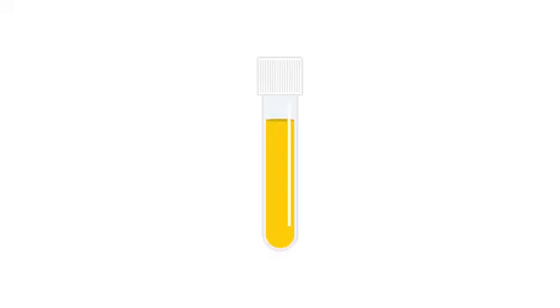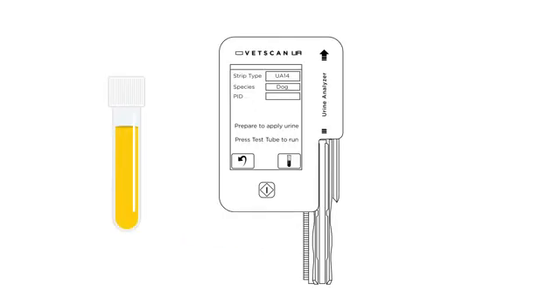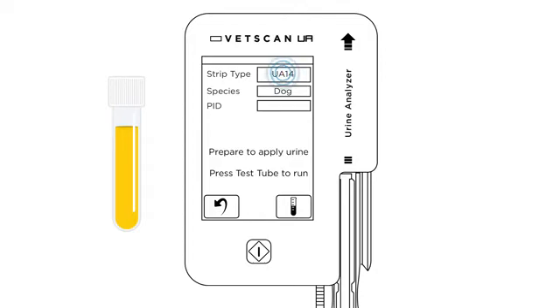Here's how it works. Acquire a urine sample before starting the UA analyzer sequence. Select strip type, then species, and enter the patient ID. Next, touch the test button.